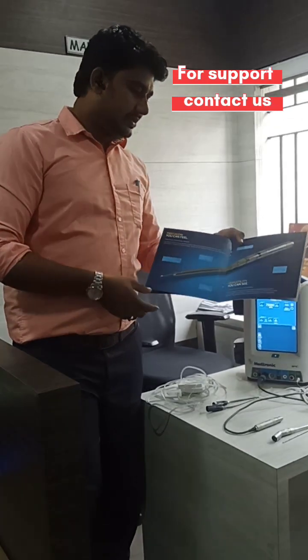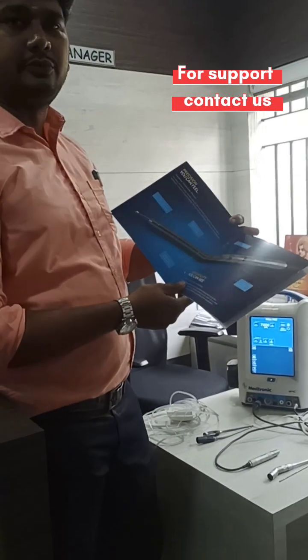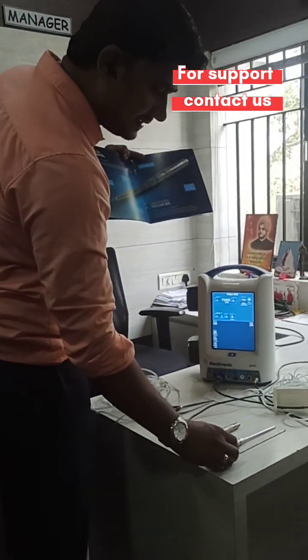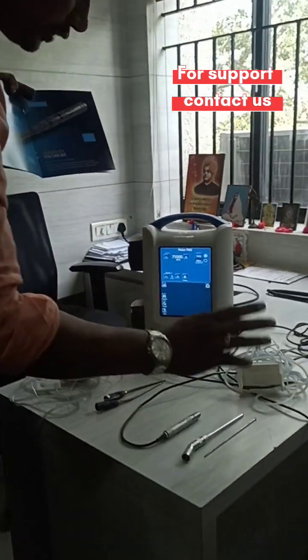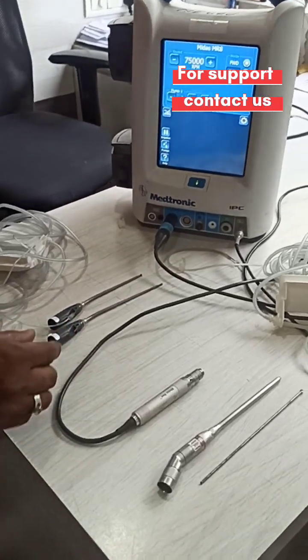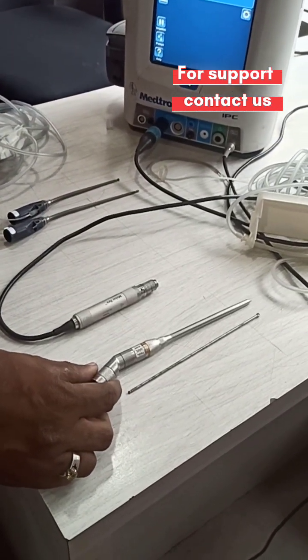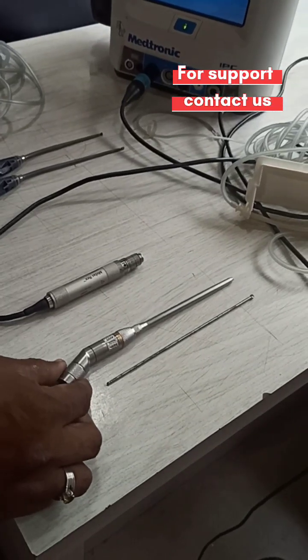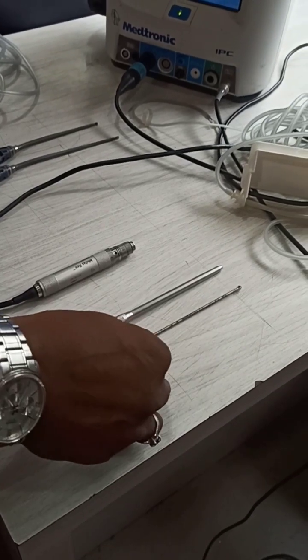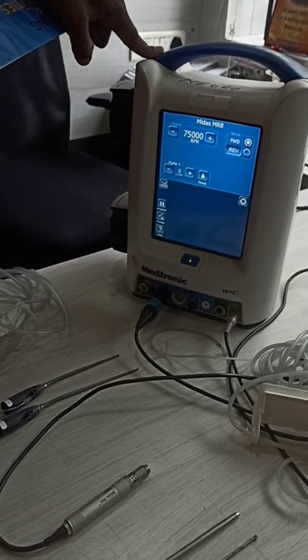Good morning friends. I am going to show you the MR-8 motor with long attachment. We have two types of attachments: one is the clear view burr, and the other is an angle attachment of 15 cm. This is the 15 cm angle attachment, this is the burr for this attachment, this is the MR-8 motor console, and then the foot pedal.